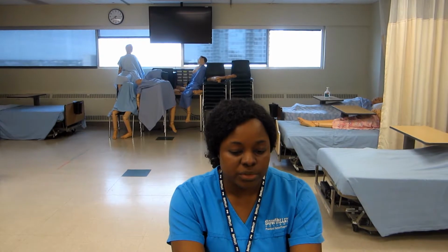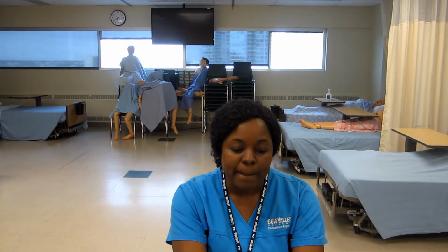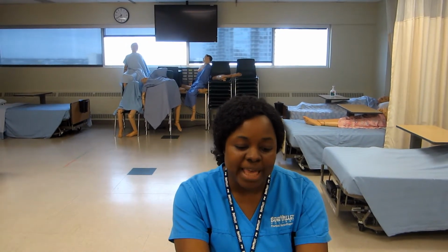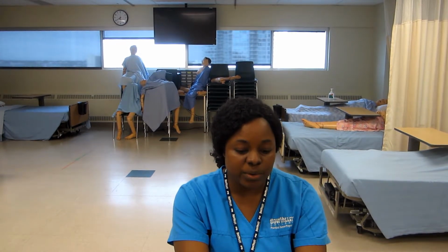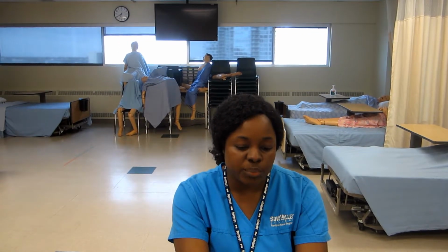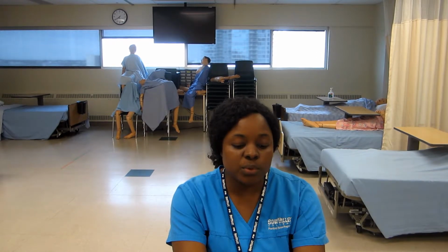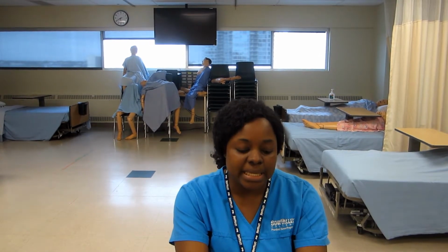Roll patient on side away from you to position patient on hydraulic sling. In positioning the sling, place lower edge on the patient's knees, upper edge on the patient's shoulders. This places the sling on the patient's center of gravity and greatest portion of body weight. Roll patient on opposite side and pull sling through. Remove patient's glasses if there are any.